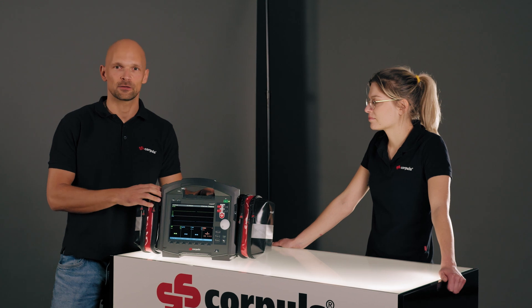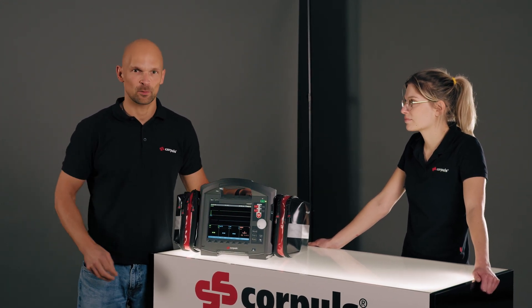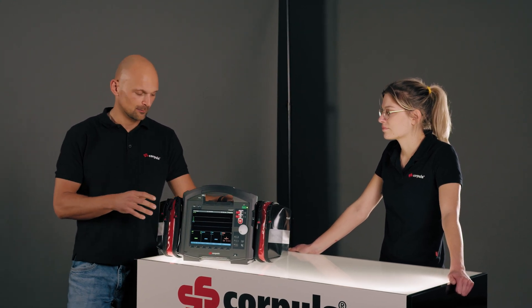If there are problems with the CF card — it is full or missing — it will be displayed here on the monitor. If I want to change it, it's found here on the left in the inside pocket.